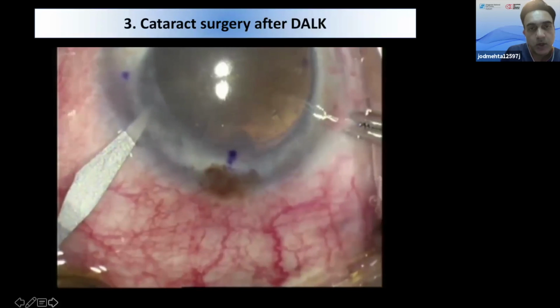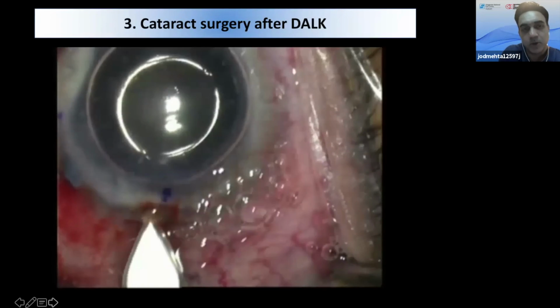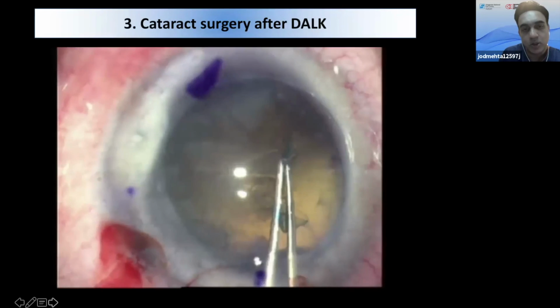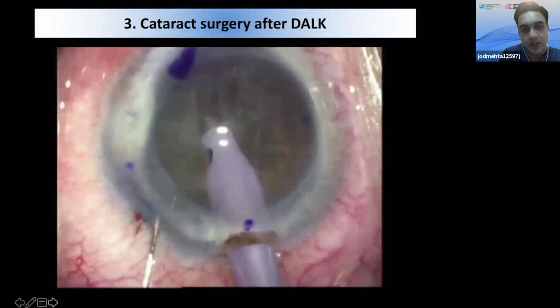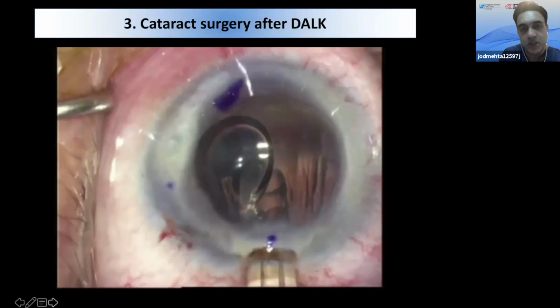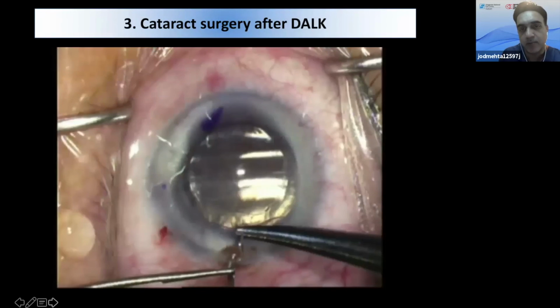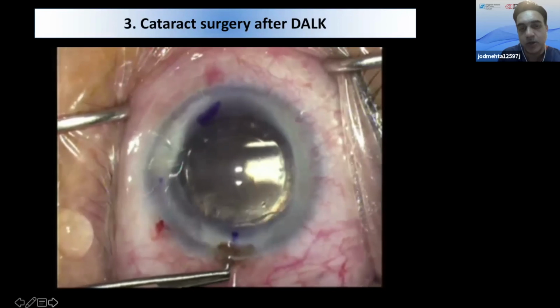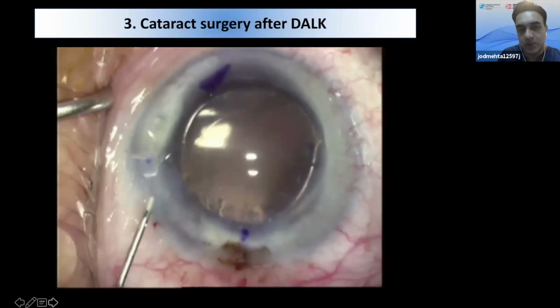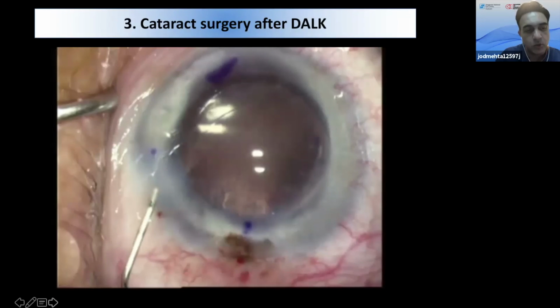Okay. So again, for the surgery, if you're doing these cases in previous DALKs, it's quite good to use VisionBlue, because sometimes when you're using coaxial illumination, the interface can affect your visual quality. Again, the lens position I find with the Zeiss lens gives you quite good tolerance. There's very little movement. I find it's normally much more stable. And it does allow you to correct slightly higher diopters of astigmatism compared to, let's say, the J&J or the Alcon lens. And generally, I'll always suture these incisions because you have differences in your tractional forces between the edge of your graft and your corneal incision.